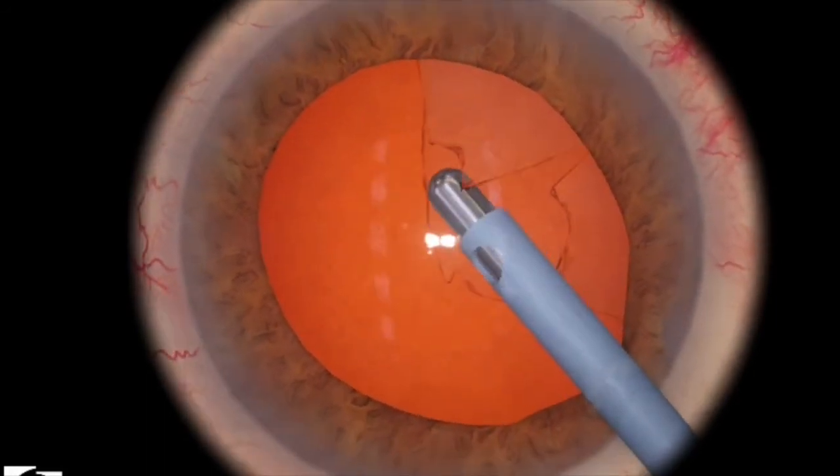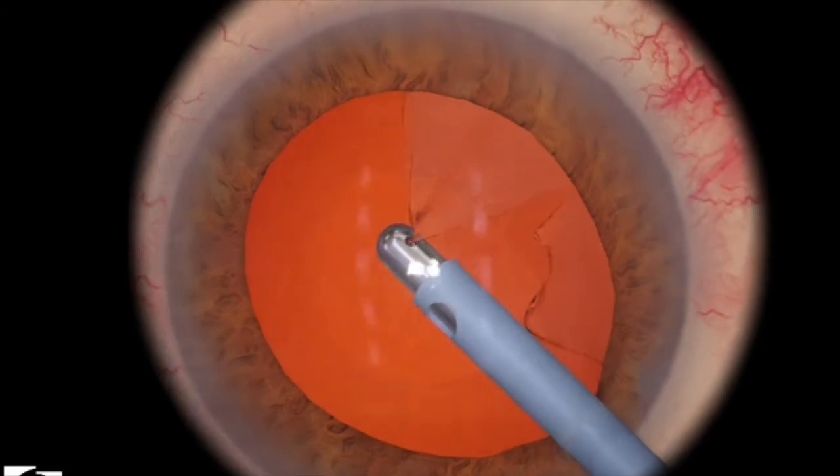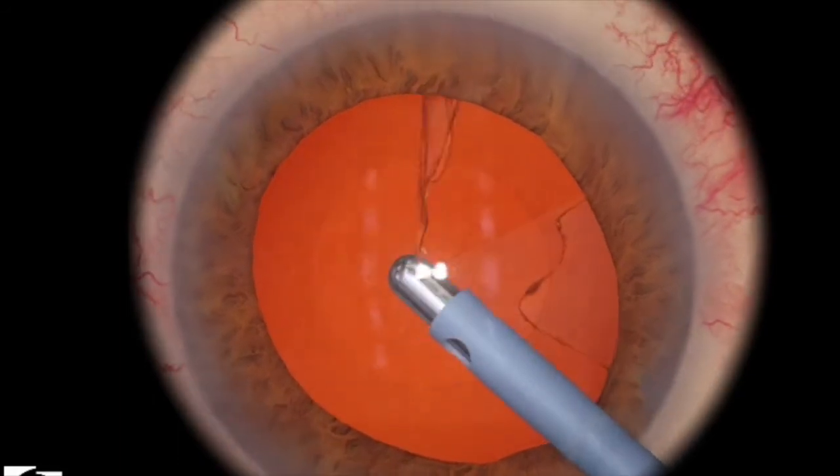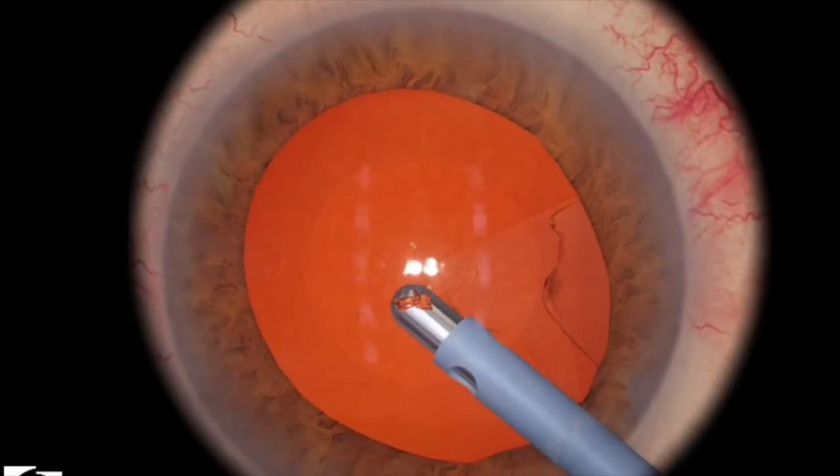Once you engage a piece, you just want to pull, and then most of the cortex should come with you. Here I've engaged a nice big piece, I've grabbed it, and the other small pieces will come along just very nicely.